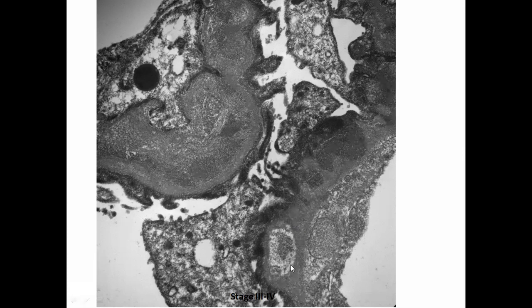They will be more electron lucent. There will be more thickening of the glomerular basement membrane, because the deposits from the subepithelial location become more intramembranous in the advanced stages of membranous. In stage 3, you will find some deposits which are electron dense. In stage 4, the majority of the deposits will be electron lucent.